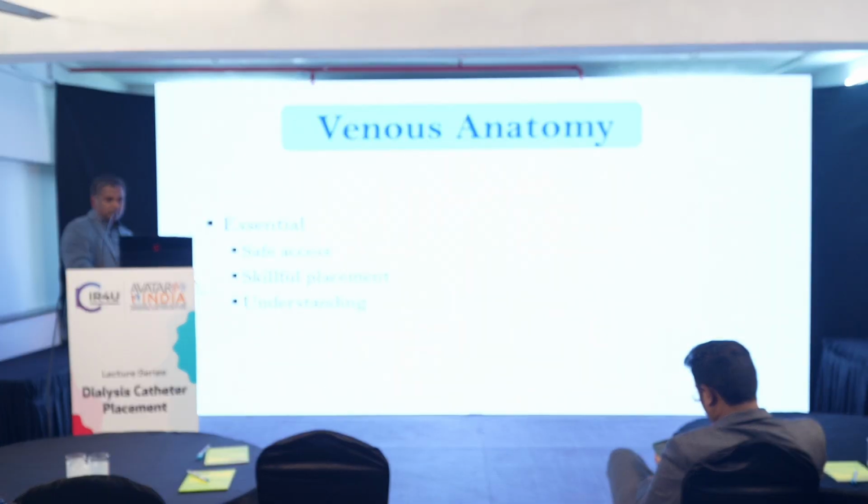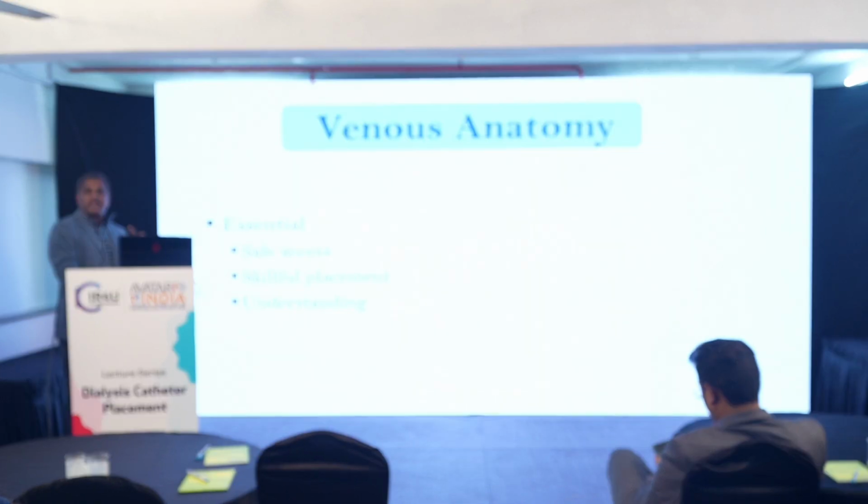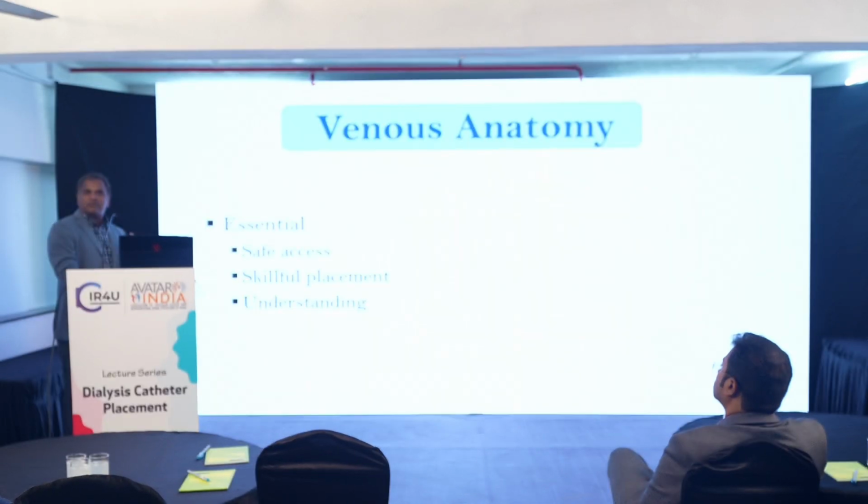So in a nutshell, venous anatomy is the basic step which is needed for placing a hemodialysis catheter. It's for safe access. Even for any skillful placement of this catheter, you should have a basic understanding of the venous anatomy.